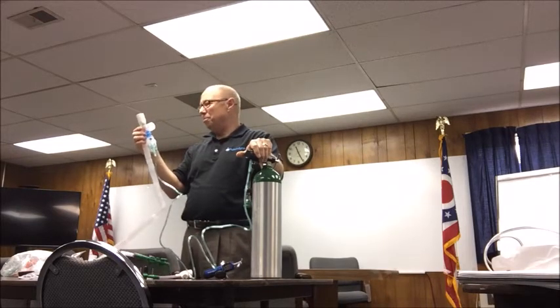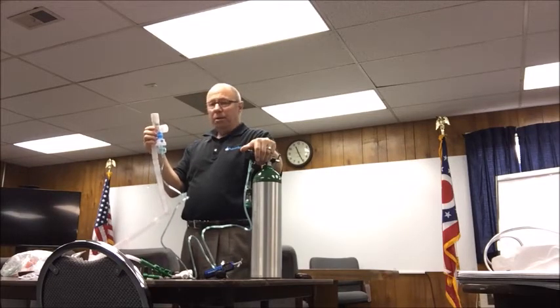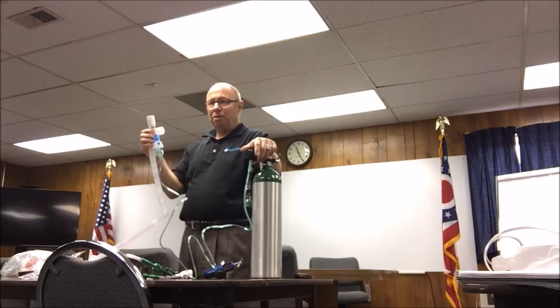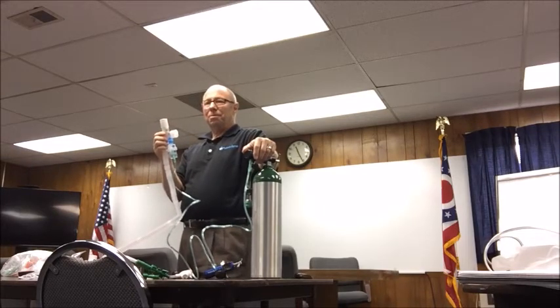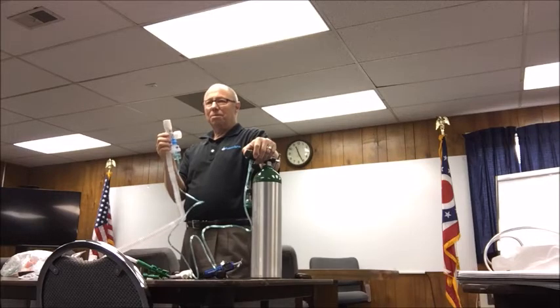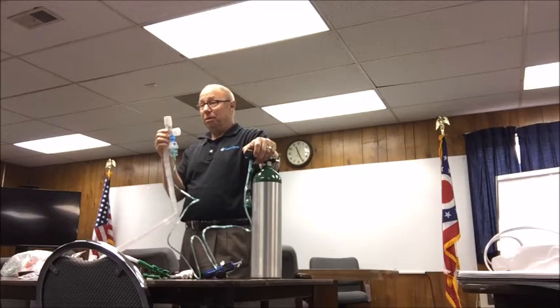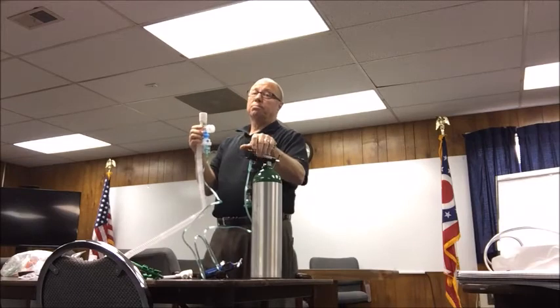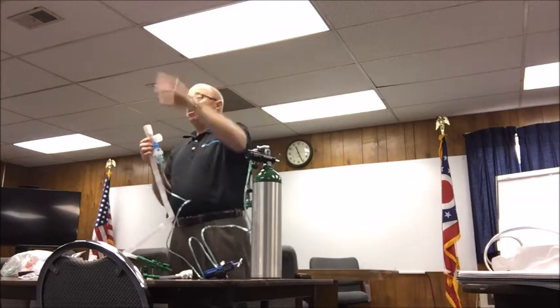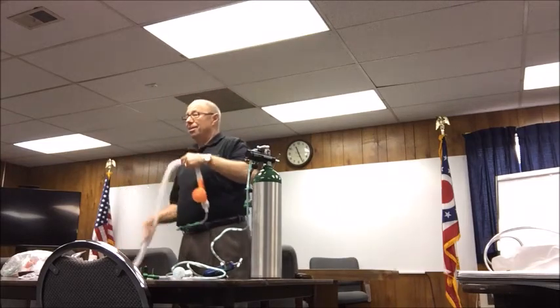Any questions about that? I wish I could make this hard, but it's not real hard. Especially y'all that have been using CPAP, so you understand what's going on. Any questions before we move on to something else? Everybody comfortable with 30% FiO2? That's kind of what I was going to use. The max that system is going to deliver is just 30%, but I'm going to talk about another one that's going to help you do that. Why are you uncomfortable at 30% FiO2? I wasn't uncomfortable. I'm just asking a question because there was a couple heads shaking there. That's okay. We had that before, and then we went to one that was 95%, and it did a whole lot better.